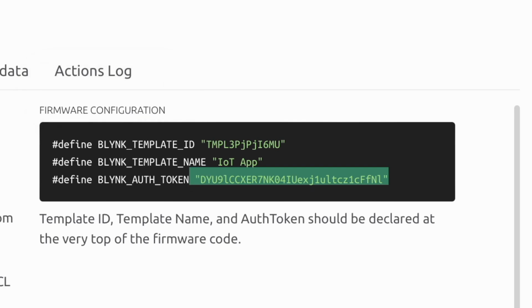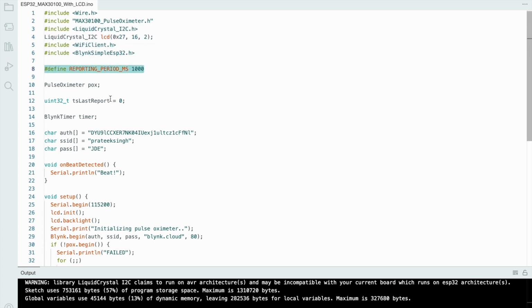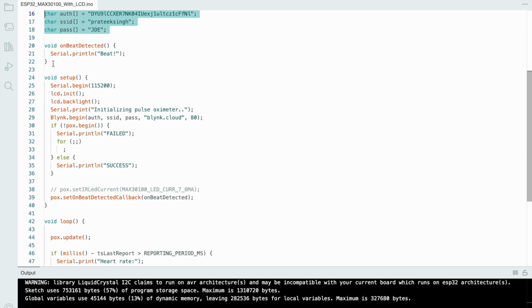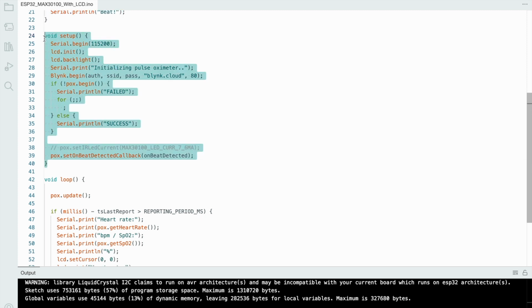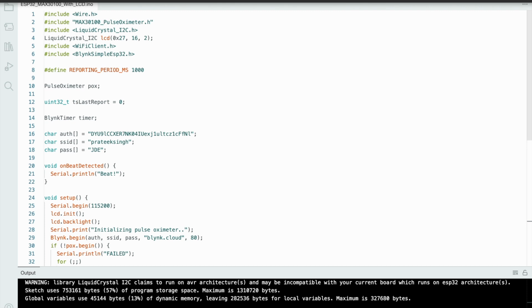Okay, now I explain this code. First you use a few libraries, that is the I2C library and the MAX30100 Pulse Oximeter library. Put the proper auth key and username, and your hotspot username and password. This is the void setup function, where I define the input and output devices. Now go to void loop, and the Pulse Oximeter will be updated every few seconds. First we take the reading and display it in the serial monitor, then it will be displayed on the LCD, and also displayed in the Blynk app.